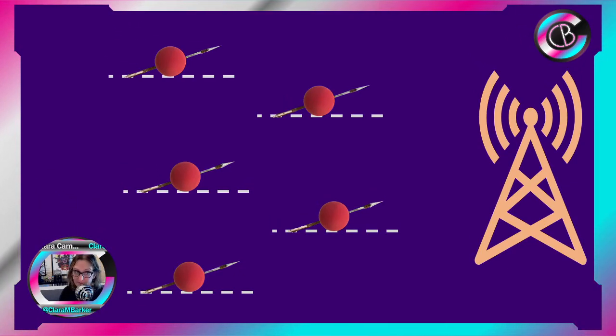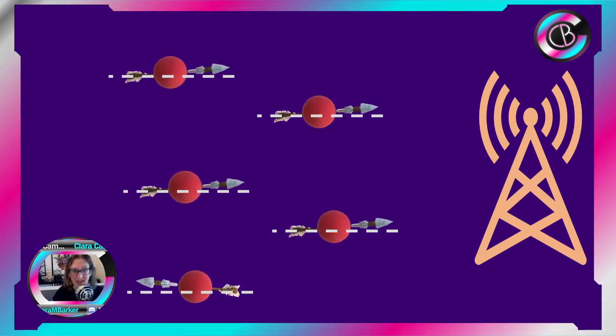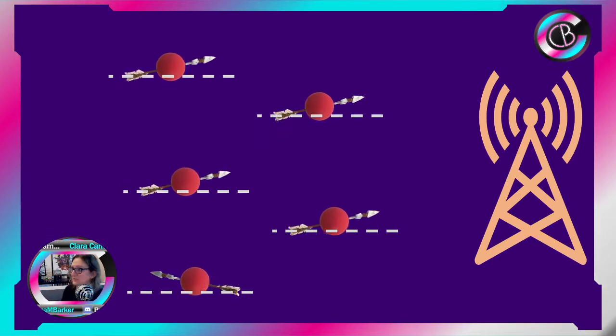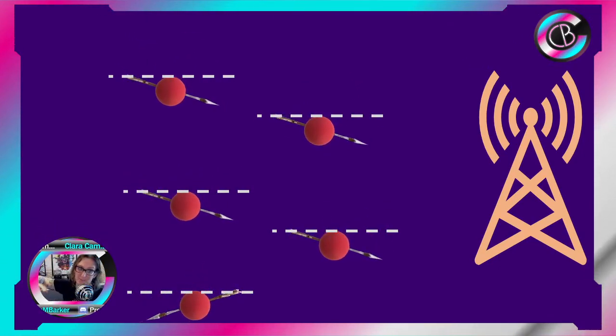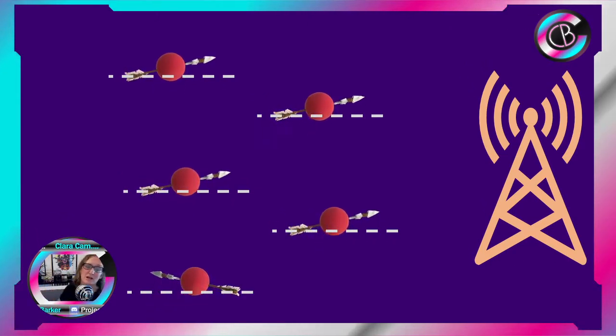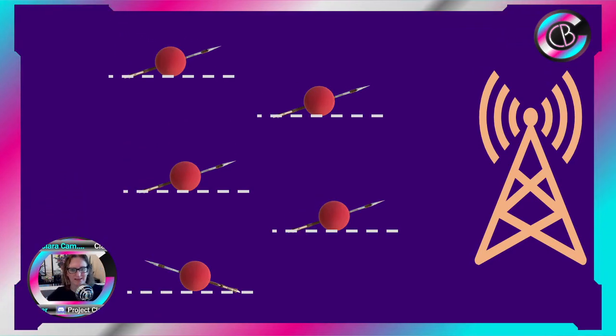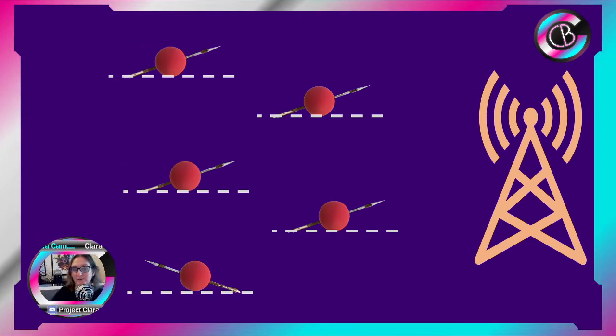But they don't want to. That's not where they want to be. And the other thing that might happen is some of them might actually flip. So instead of being in one particular direction, they're in the anti-direction. And actually quite a few of them flip. But that's not the position they want to be in. That's not where they're happy. They're doing that because we're making them, by giving them this energy.